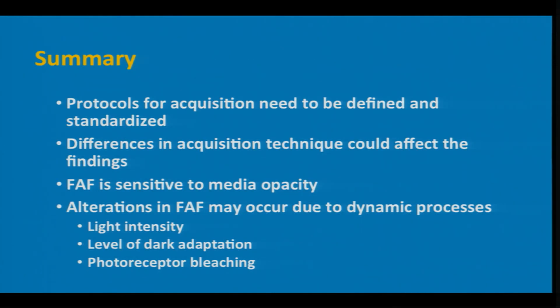To summarize, the protocols for acquisition need to be defined and standardized for doing autofluorescence. Differences in acquisition techniques could affect the findings, and FAF is very, very sensitive to media opacities. And FAF alterations may also be due to various dynamic processes, that is light intensity, level of dark adaptation, and photoreceptor bleaching.